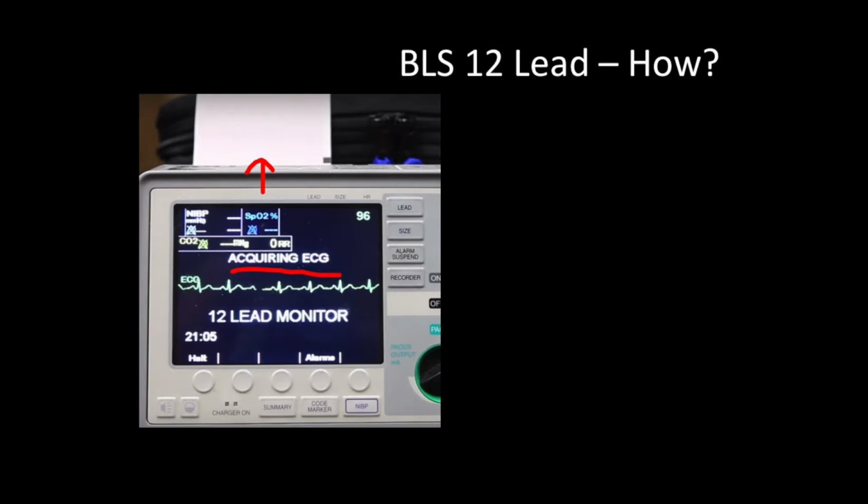And it prints, and that is it. No more than this. I am not making you put in age and date and gender and all this other stuff. I don't think that matters. They're only going to get these EKGs from us in a certain way, and that's it. And they're going to listen to our report. They have to listen to our report.